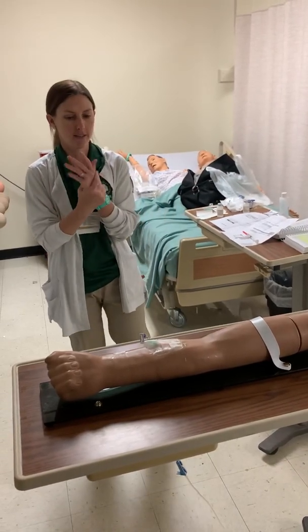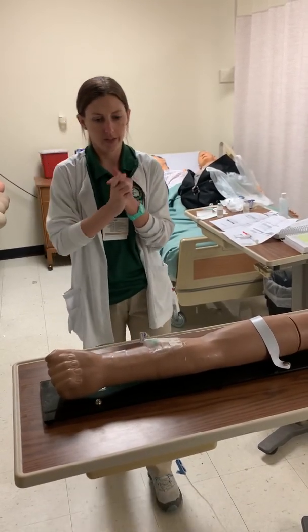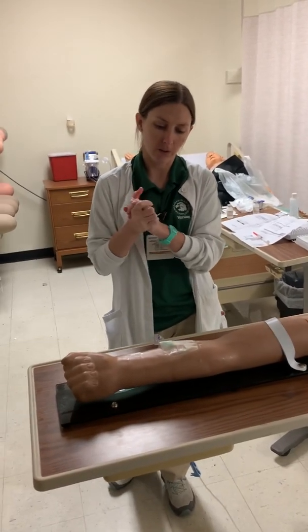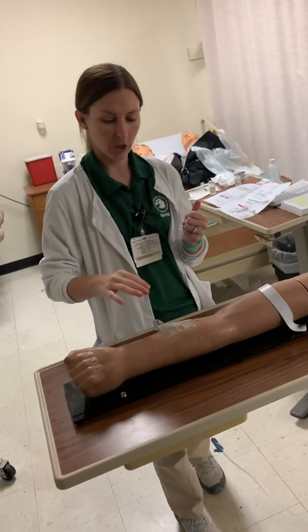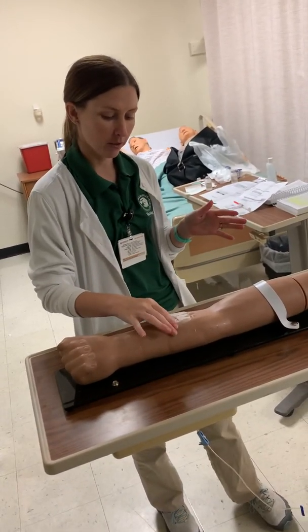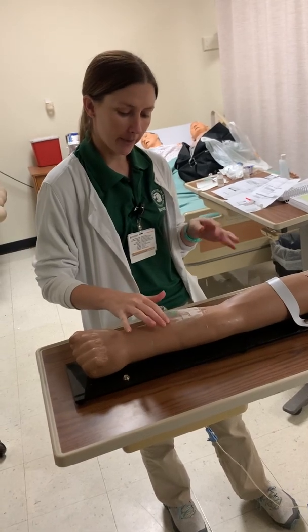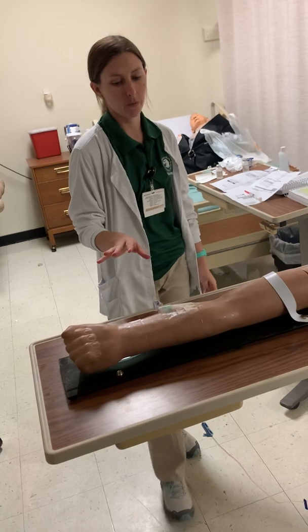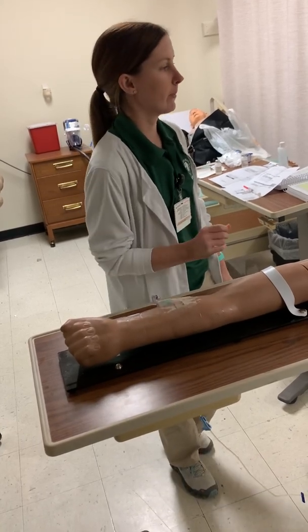I'm going to wash my hands. All right, and then I'm going to assess my IV. Before I start administering my medication, I want to make sure there's no redness, swelling. I want to ask my patient if they're having any pain in their IV site, any leaking fluids, anything of any concern. If there was, then I would want to make sure to fix that before administering the medication.